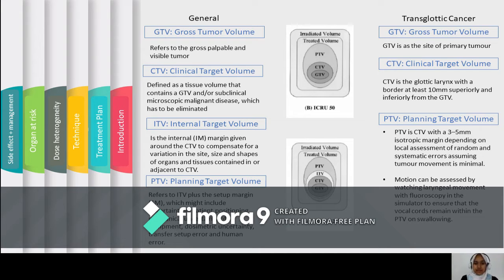According to ICRU 50, if the aim of therapy is for palliation, the therapy is done just to reduce the symptom and it may include all or only part of the tumor. In this case, palliative treatment may reduce pain and reduce dysphagia caused by tumor or tumor ulceration in the neck.